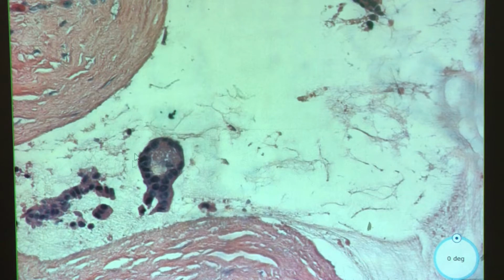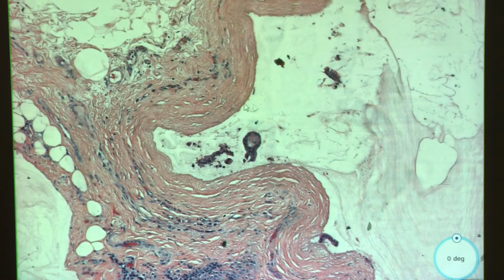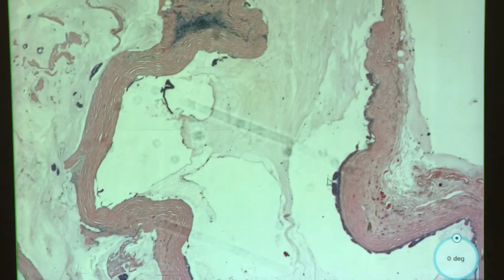These are lesional cells, and too much and too big for me to say, like, am I still in like the ADH realm? So this is way too much. They're swimming in all this mucin, and everything's detached. And all this atypical stuff, none of it is attached. Maybe this stuff is.